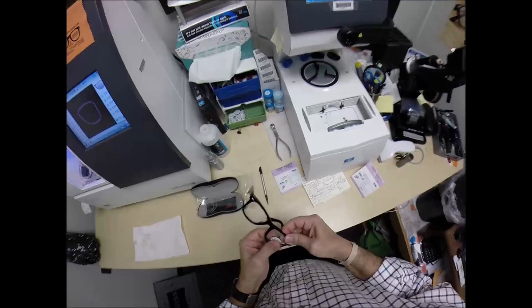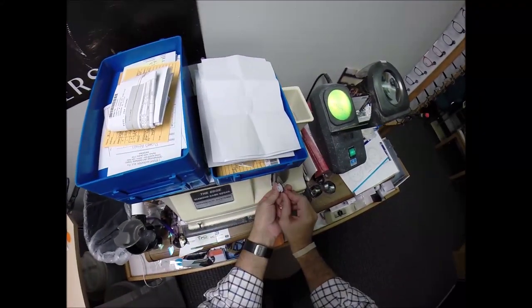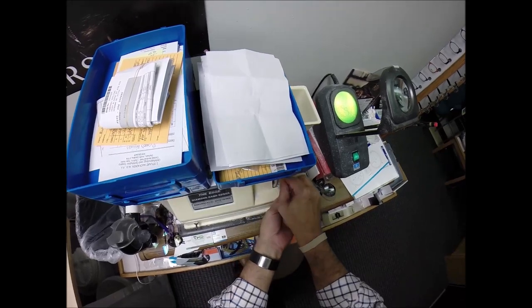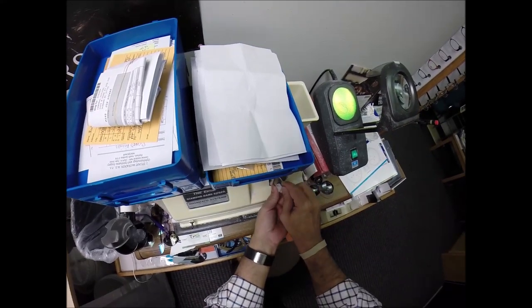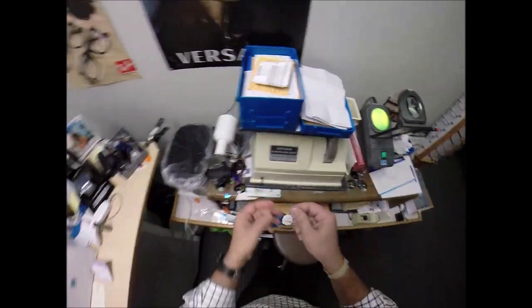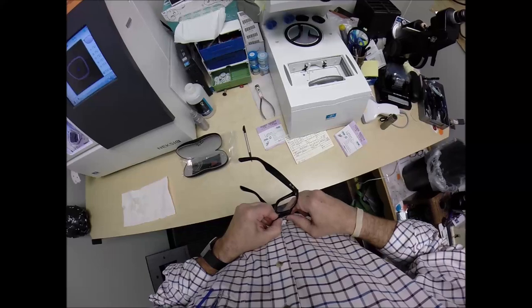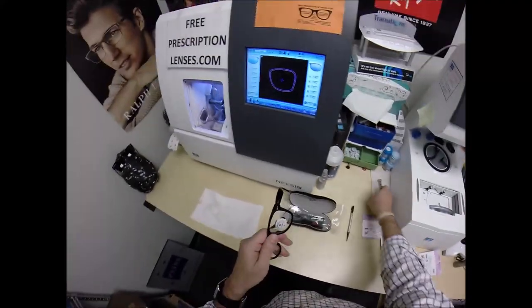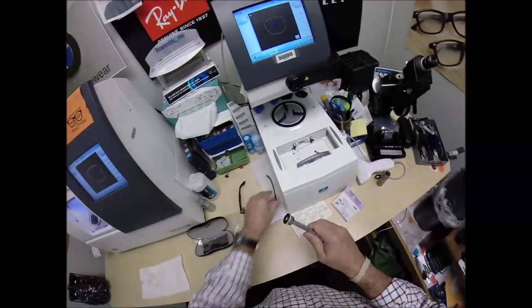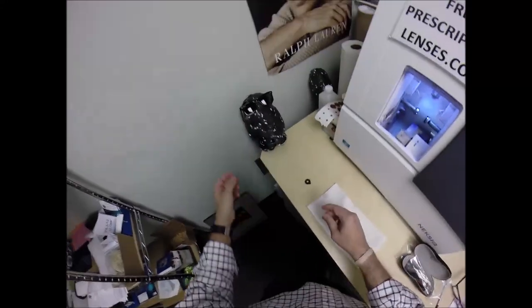It doesn't want to go in — I'm going to go old school. Instead of taking it down on the machine, I'm going to go around and take a little bit off on my hand stone. This is just like the bevel wheel except I'm doing it by hand. Then it snaps in there easily.